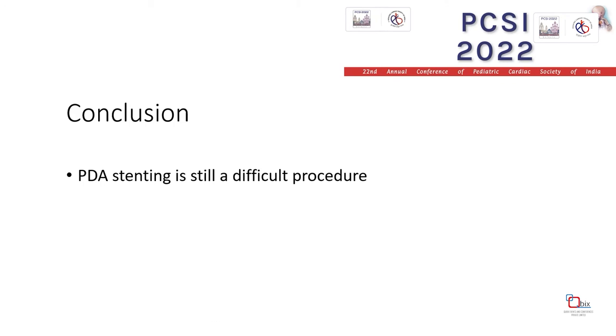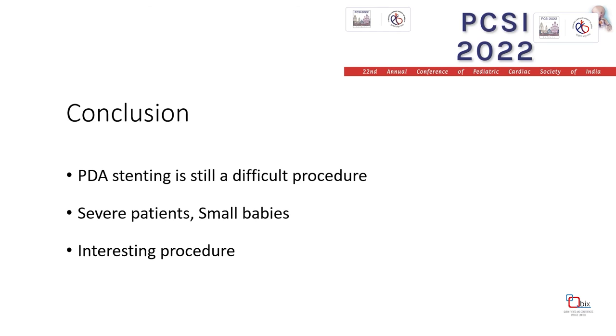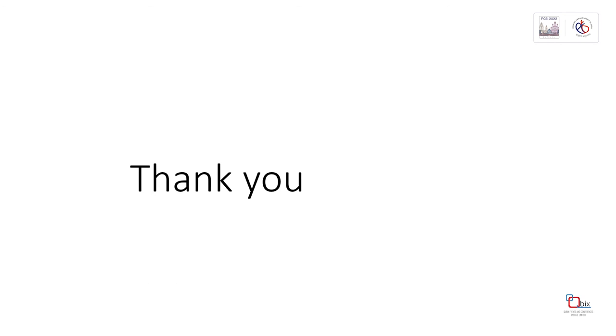And for my conclusion, PDA stenting is still a difficult procedure. All cases are challenging because most patients are very severe patients and very small babies. But it's a very interesting procedure. The result is acceptable for bridging to the surgical repair later. And thank you very much for listening.